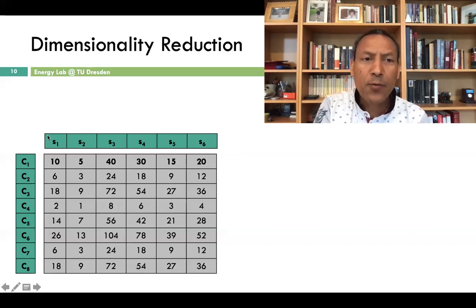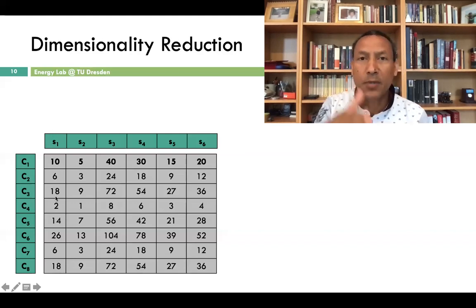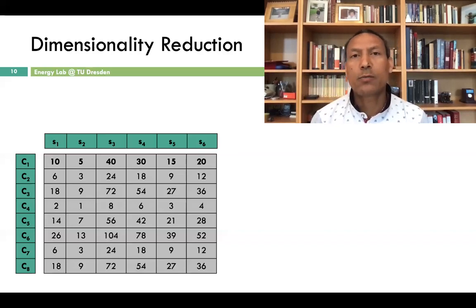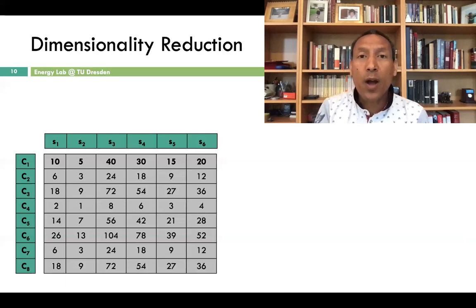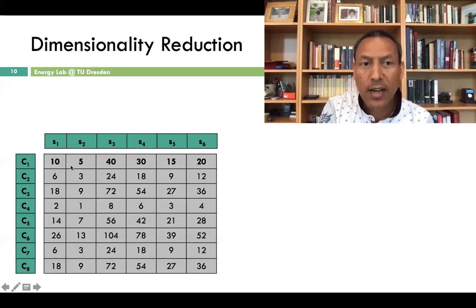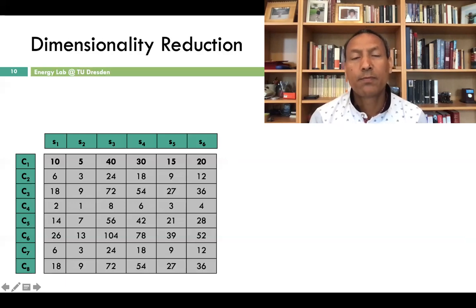For example, if we want to know whether the patient is well at this point in time, we can plot the observation of all of them. That means we take just the vertical data and plot them. Or if we want to focus on one channel for a long time, we can take all the data along this line and plot them.